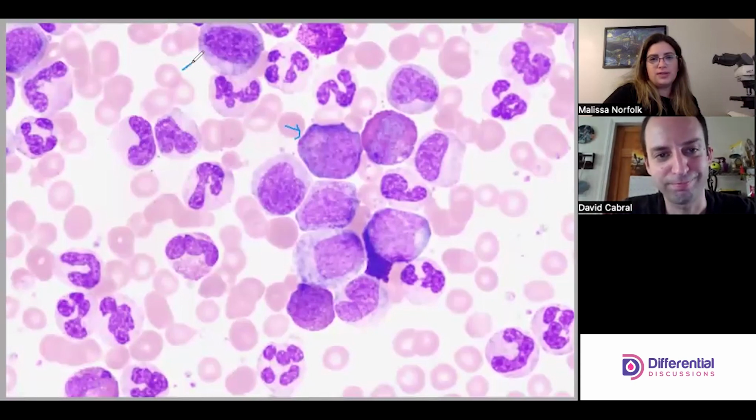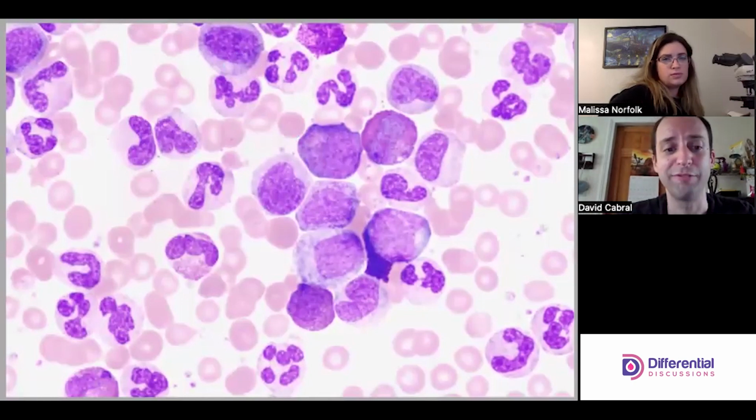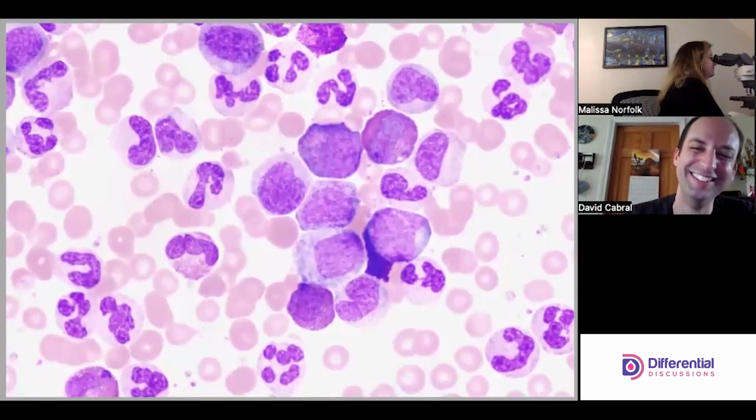You know what? This guy here has a really nice Golgi clearing. It does. There are some really good myelos. You could teach immature grans, I think, off of CML. What do you think? I mean, absolutely, it's not a bad slide to practice that on. CMLs are great. Better than our M2 that we talked about with all that dysplasia.